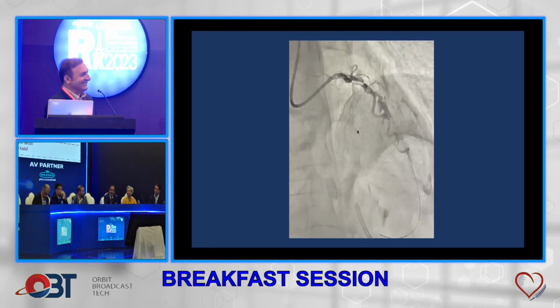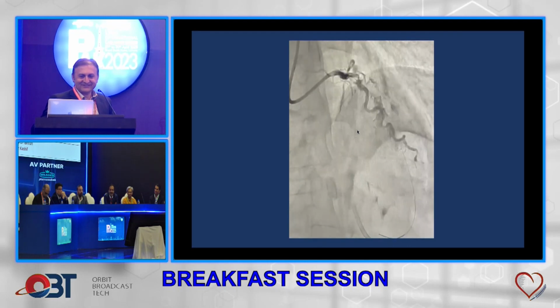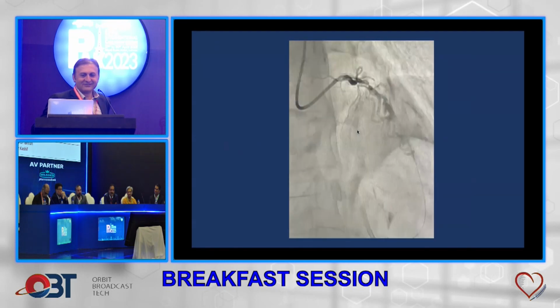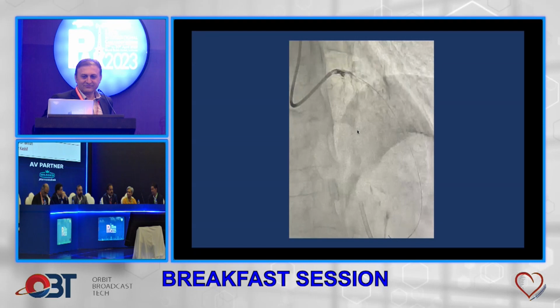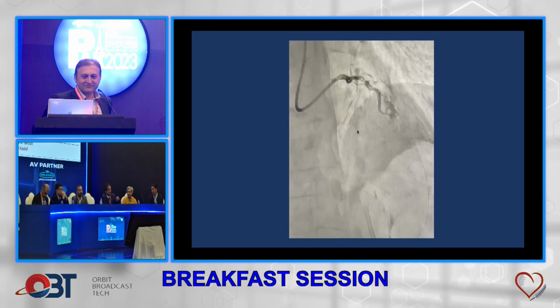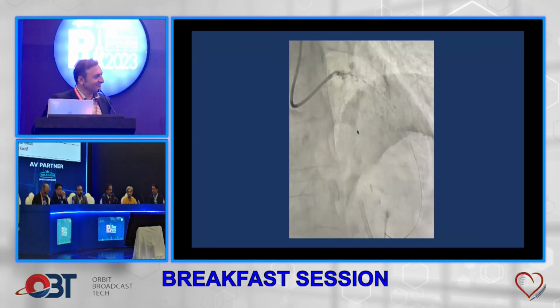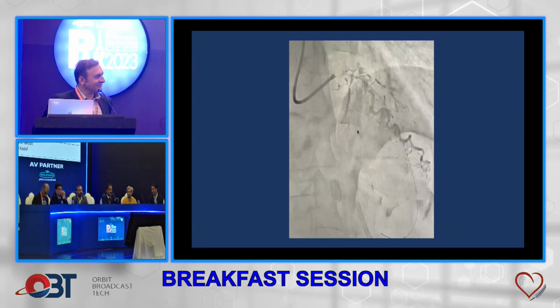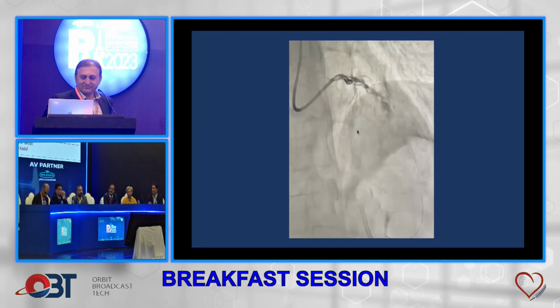I think it's not a question of being keen. The surgeon, you don't have any options. Obviously, you were lucky, probably may have been able to save this, but that's why when I was saying, Badar, that I try to do something simpler. Although when it is a CTO and I know it's going to be difficult, I may not be able to cross it, then I would say, okay, I will do that. That's going to make me decide whether I send him for surgery or proceed with angioplasty. But here, other than the diagonal, the LAD was a short segment, and I was pretty confident that I'll be able to cross. That's why I said so, because now, if you have the right as a problem, the circ as a problem, this patient would crash on you. So he's been lucky that he was fine.